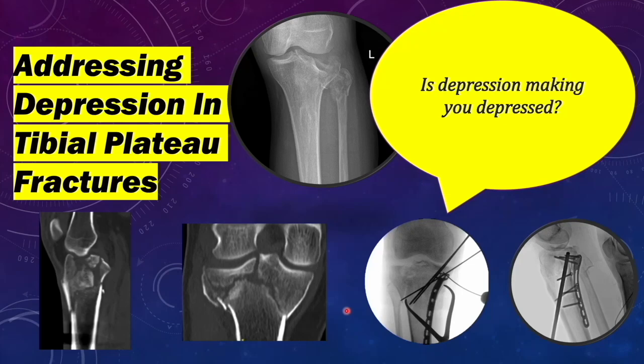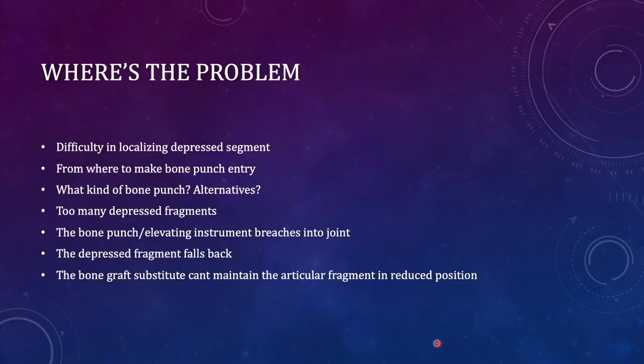Friends, in today's video, I will be discussing the reduction techniques that are required for elevation of depression in tibial plateau fractures. Often the residents face problems with elevation of depression in tibial plateau fractures, and after surveying the residents, I was able to pinpoint these particular problems when elevating the depression.